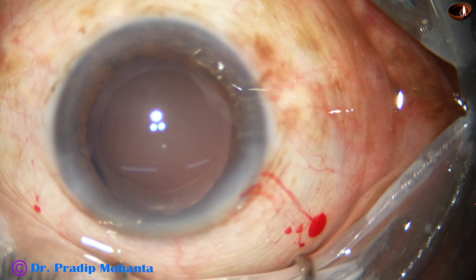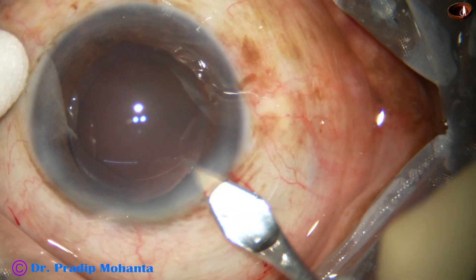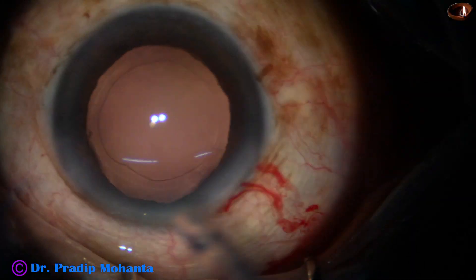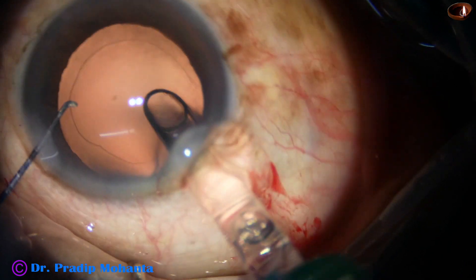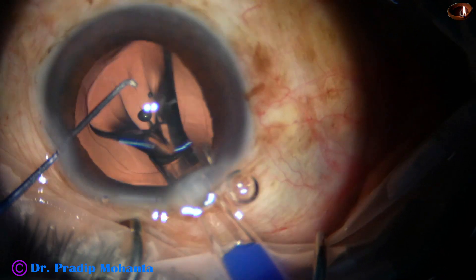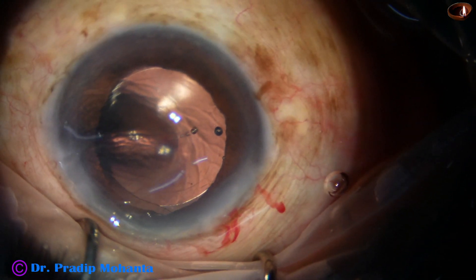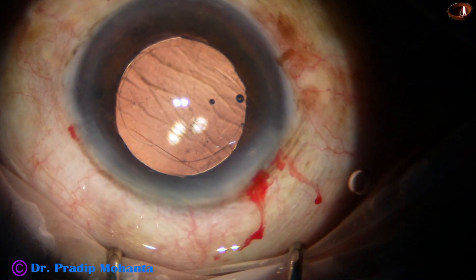I am planning to enlarge the main wound with just one cut so that I do not cause stress to the main wound. Here goes the intraocular lens. The leading haptic goes into the capsular bag and the trailing haptic is not in the bag — it has been placed in the bag by the left hand instrument, which is Mohanta's chopper.